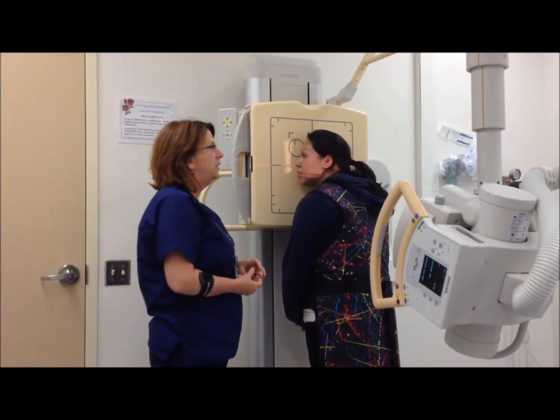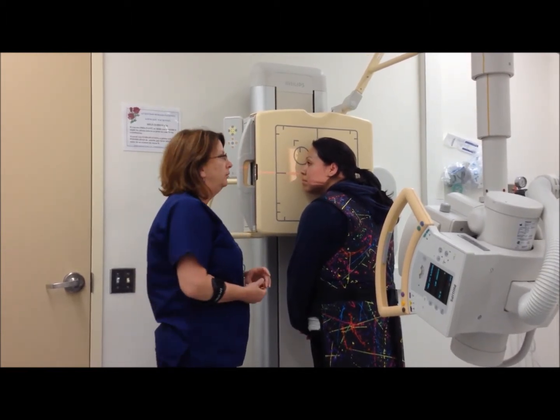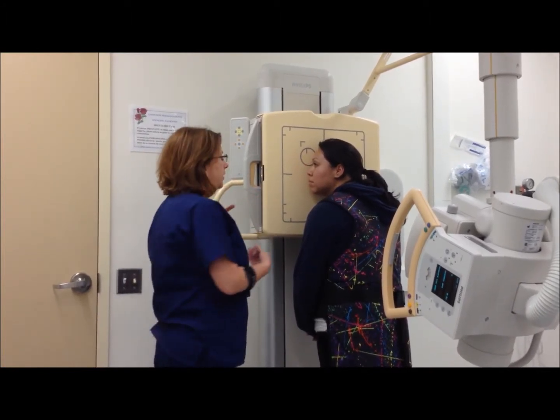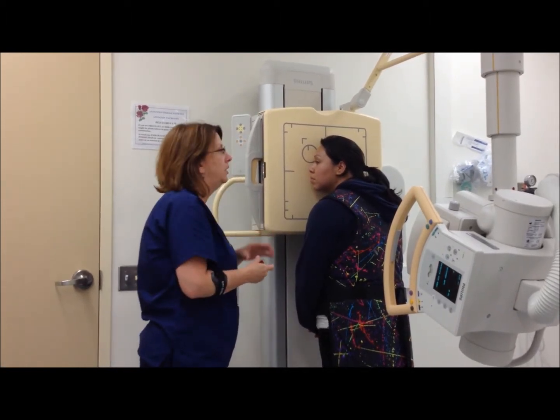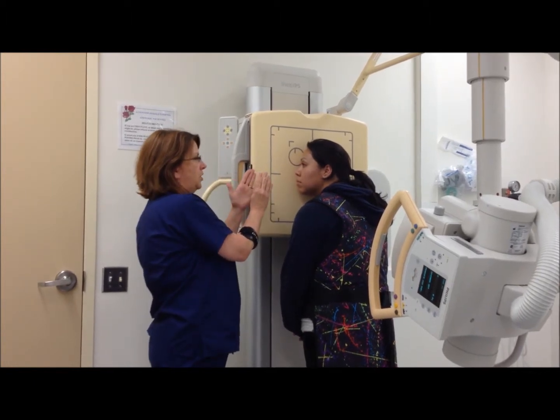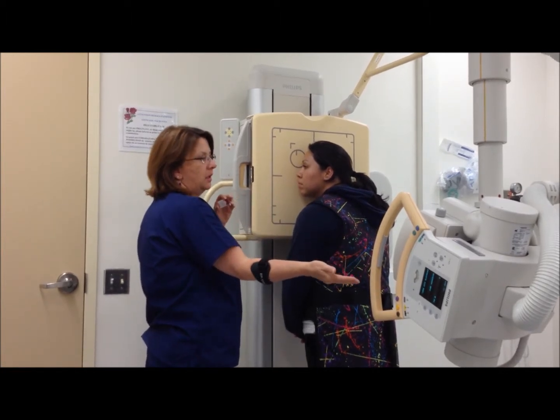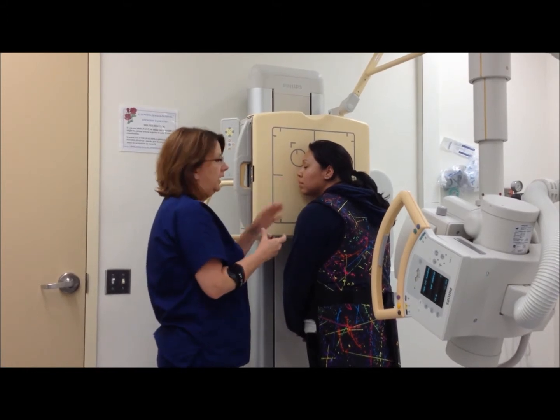Okay, for our next mandible images, I'm going to be doing an axiolateral oblique image for the mandibular body on an 8x10 cassette. I'm going to be doing a right and a left. The first one is going to be her right cheek to the IR, so we'll be imaging the right side. The MSP is rotated 30 degrees from true lateral toward the board. My angle on my tube is 20 to 25 degrees cephalic. It will exit at the acanthion.